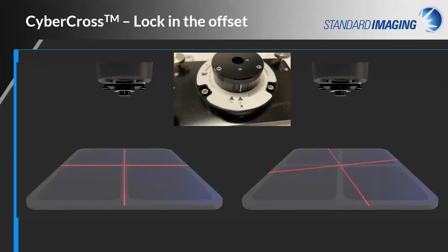CyberKnife commissioning and annual QA require the acquisition of scans at a 15-degree offset. Once again, a laser point is insufficient for easy alignment of a 3D water scanning system. This task is made fast and easy with the CyberCross installed and locked in the offset position.